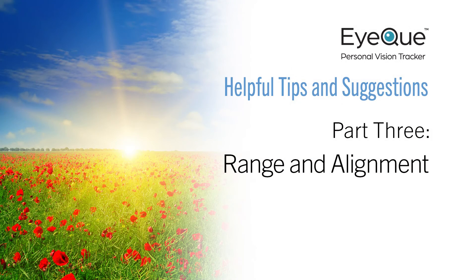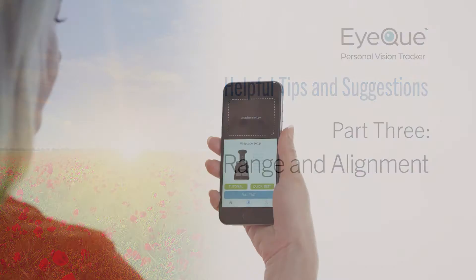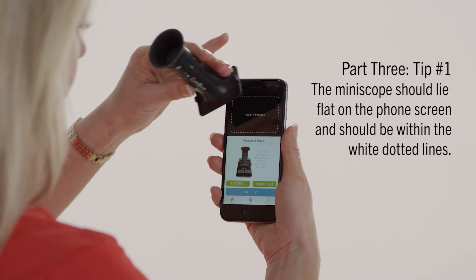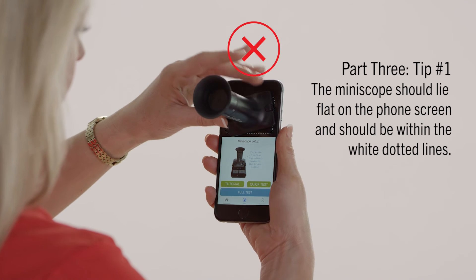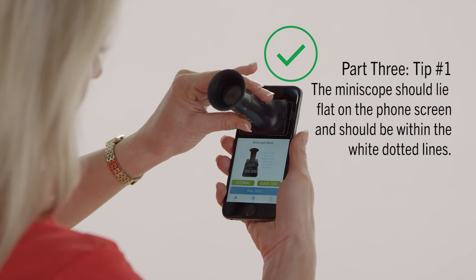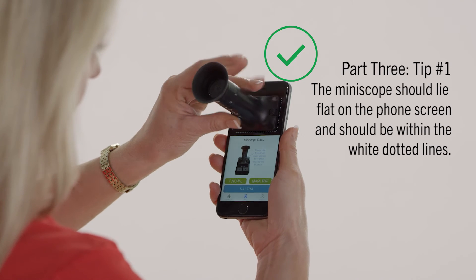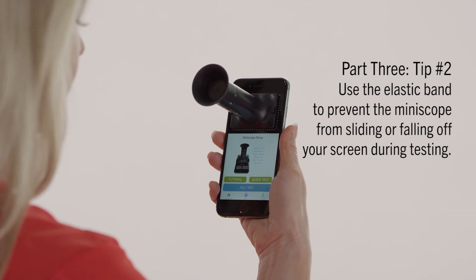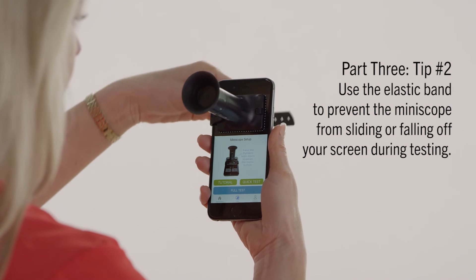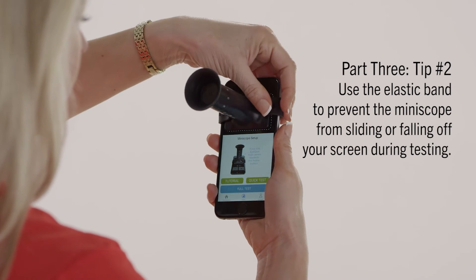Our final segment contains tips and troubleshooting techniques for range and alignment. The Miniscope should be attached to your smartphone screen exactly within the white dotted lines that are displayed on the test screen. It should lie flat on the phone's screen and not be tilted or placed outside of the white dotted lines. Remember to use the elastic band for a more secure fit and to prevent the Miniscope from sliding on your screen during testing.